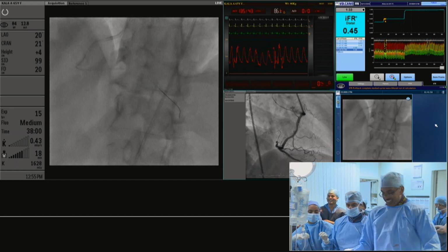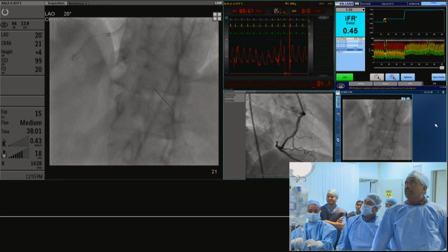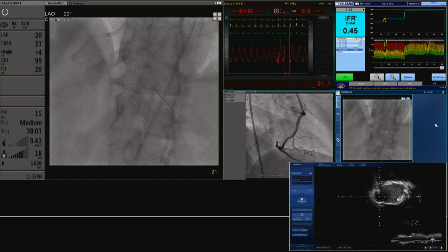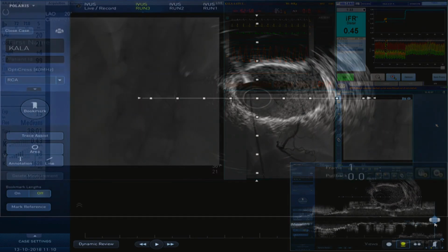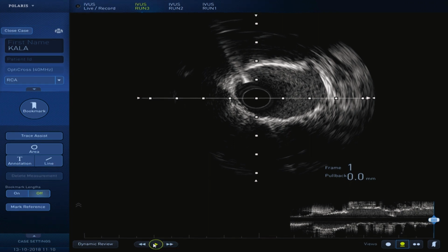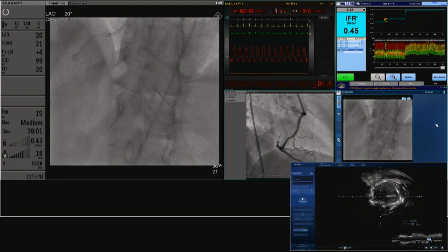Ajit, are you having difficulty putting in that IVUS scan? Yeah, it was going down, but I could not get beyond the stent and take some pictures. It is just the bend. This is the major reason that Ajit wanted to take a long stent down first, a 38 millimeter long stent, not only because of the calcium, but because of the tortuosity distal to the stent part, it is difficult to take a device down. That is why probably he would have taken the first stent.